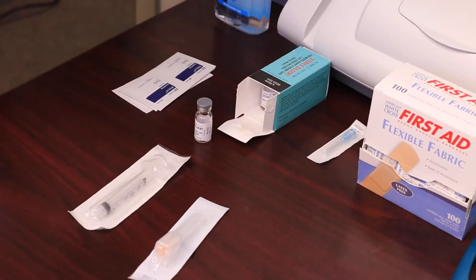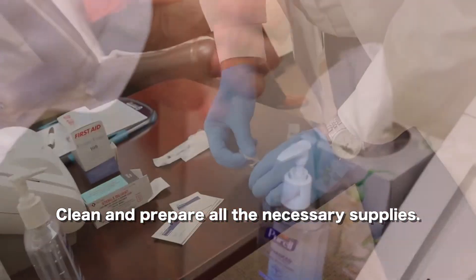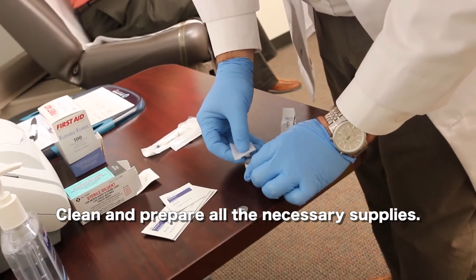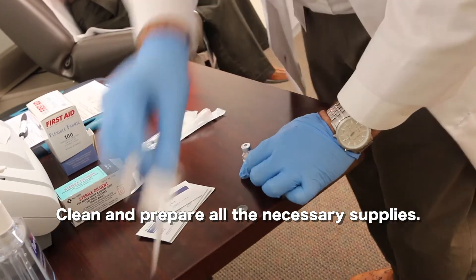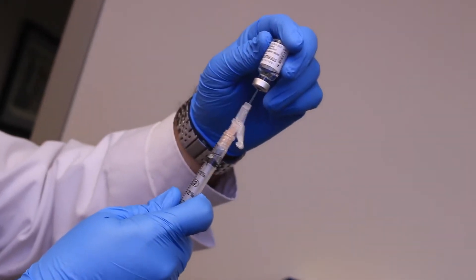The second step is to clean and prepare all the supplies that are going to be needed for the injection. You'll need a syringe with a needle and the injectable substance. It's important to make sure that an alcohol swab is used to clean the surface of the vial before it's drawn up into the syringe.